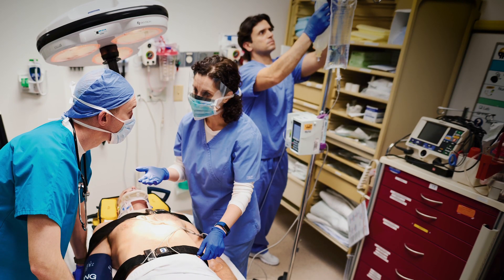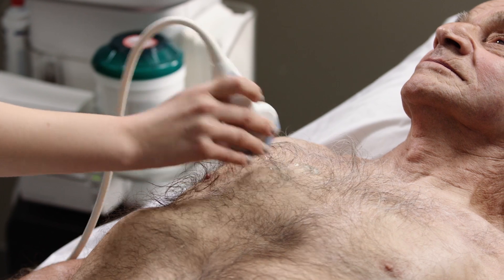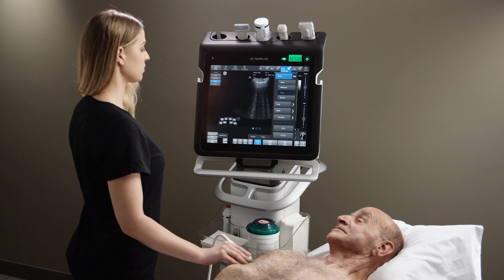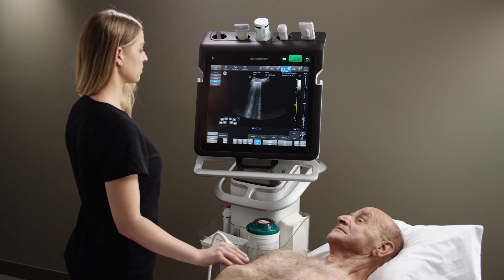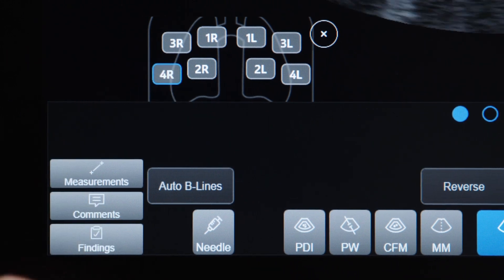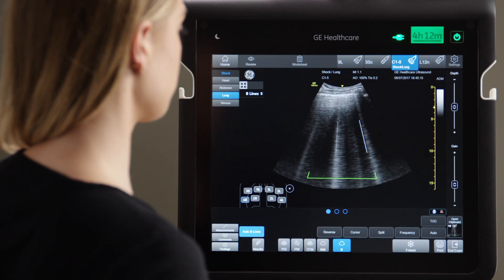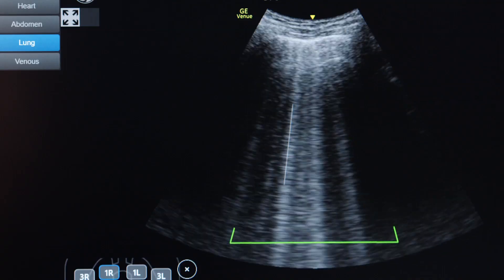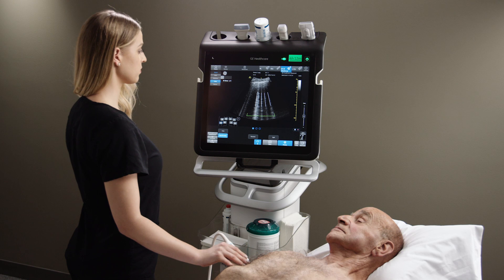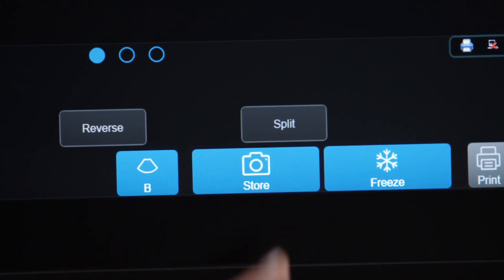You may want to check for B-lines to help confirm cardiogenic shock or assess volume overload and pulmonary edema. Using Venue, find your standard view of the lung across the ribs or along the ribs and select the lung segment in which you will scan. Press the Auto Beeline tool. Venue highlights and counts beelines in real-time. Press Freeze and Venue automatically searches and displays the frame with the highest beeline count, saving it to the lung segment you were scanning.